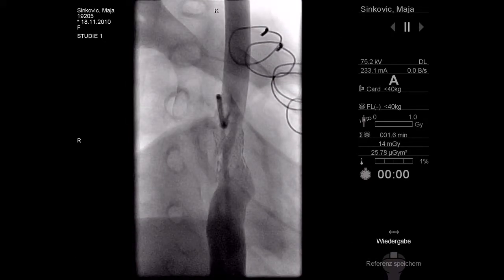Yes. Can you just talk to us a little bit about the formula stent, and is this the stent that you usually use in toddlers when you need to stent the arch, and how much do you think you can dilate it? It was 8 millimeters to start. Yeah, well, we think this is now 8 millimeter. We will go up to 10. We could easily go to 12, and later on, hopefully, we can crack it and put a larger stent inside. But up to now, we think 10 millimeters must be okay.